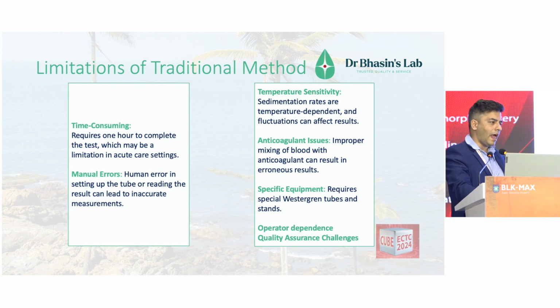That really has a big impact on comprehensive turnaround time for us. Manual errors are immense because again the labeling is completely manual. You are writing on a sheet across the stand. You have numbered the sheets. In the current laboratory methods, we are moving more and more towards, we are almost completely at barcoded systems. So the human error is very high.